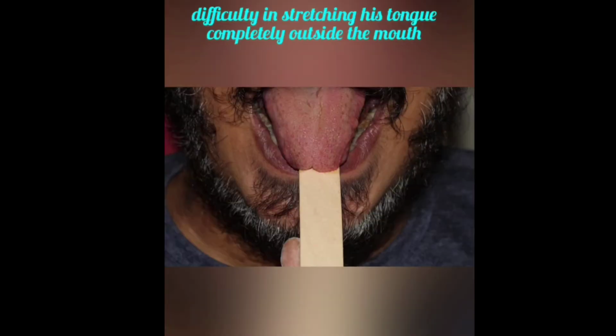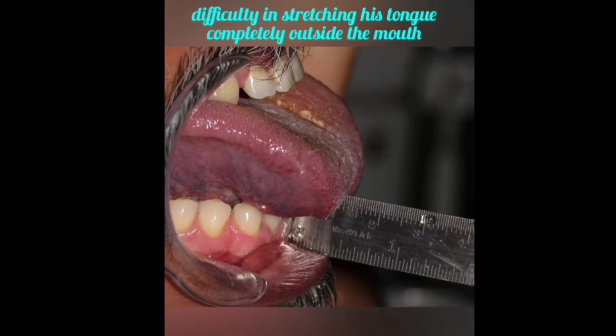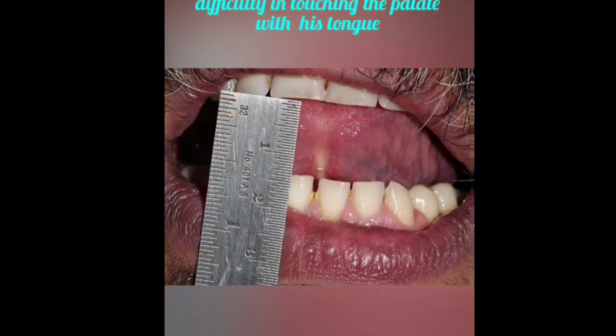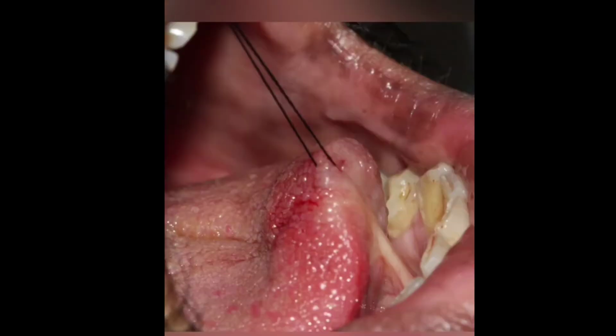A 43-year-old patient reported to the Department of Periodontology with a chief complaint of discomfort in tongue movement leading to difficulty in speech, difficulty in stretching his tongue completely outside the mouth, and difficulty in touching the palate with his tongue. On intraoral examination, a short, thick lingual frenum was detected. After taking consent from the patient, lingual frenectomy with diode laser under local anesthesia was planned.